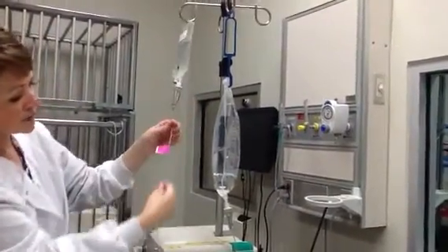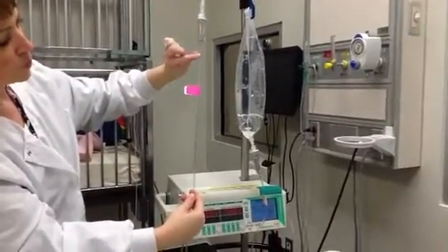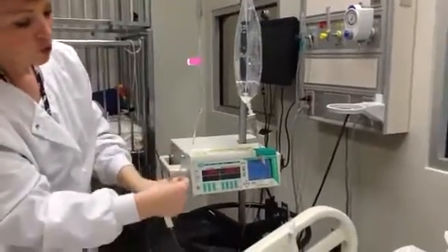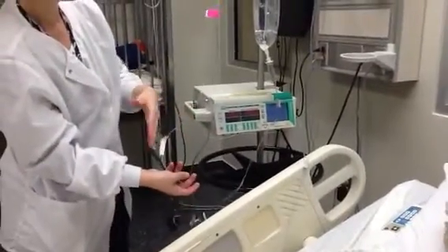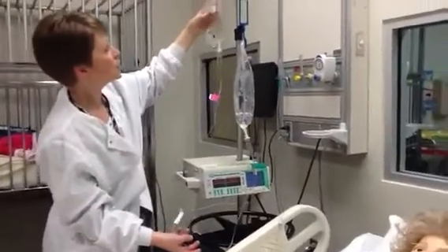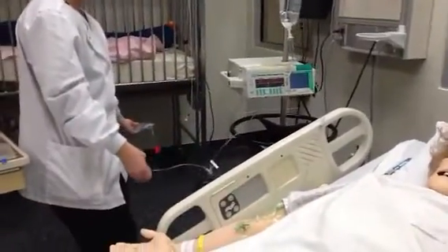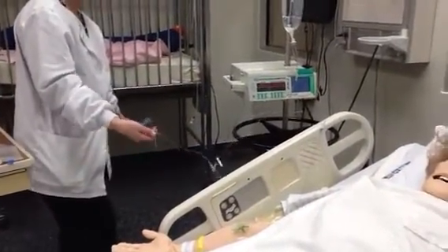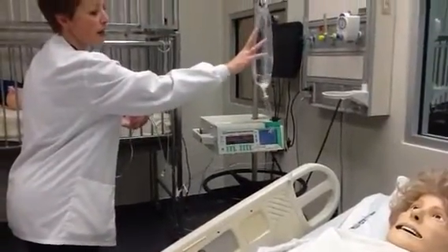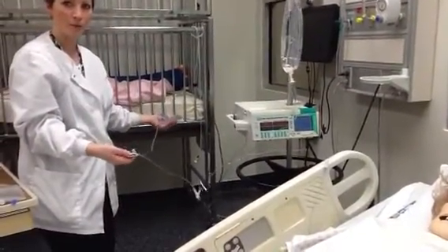Now, I don't know if you could see it on the video, but there is no solution here in the chamber, and if you go through here, you can see there's a bunch of air bubbles throughout the tubing. So what we need to do is we need to prime this tubing so that it's ready to go. And so how you can do that is you can actually bring this down below the pump level and open up the roller clamp. And as you do that, the solution from the primary bag is going to backflow through this tubing to prime your bag.